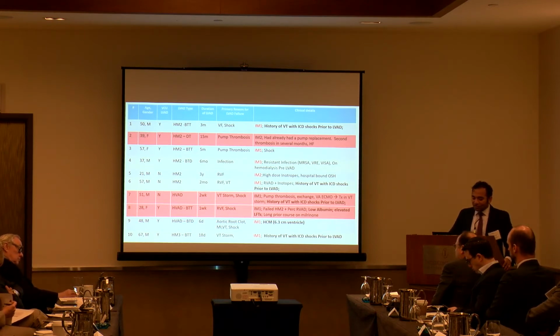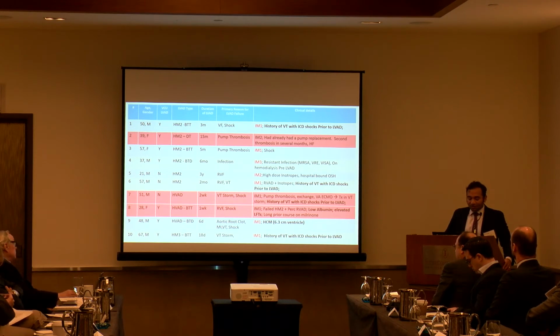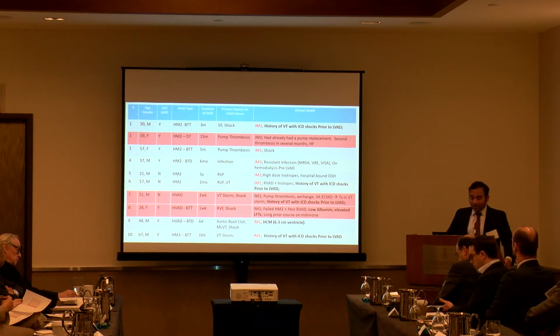most of these patients, and I tried to put what I thought were the primary reasons the LVAD was not successful. The 4 RV failure patients, if we look at those first, all of them came in as either Intermacs 1 and 2. 2 of them were referrals from outside hospitals, and 2 were our own. And generally, these were patients who had hemodynamic collapse early after LVAD implantation.